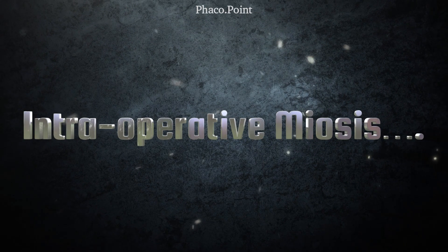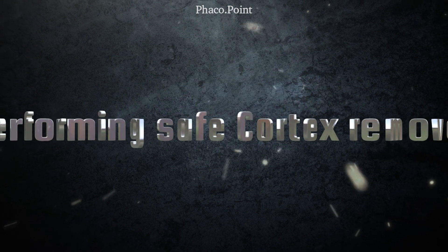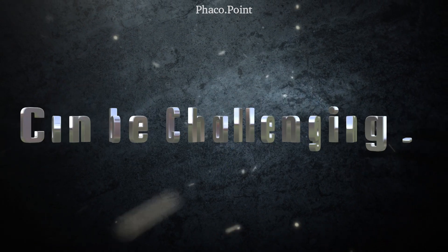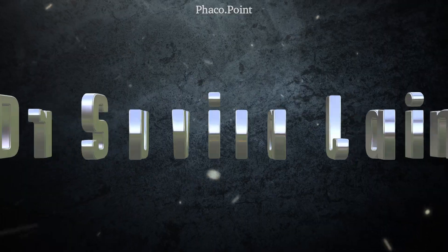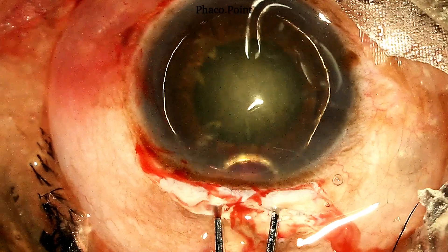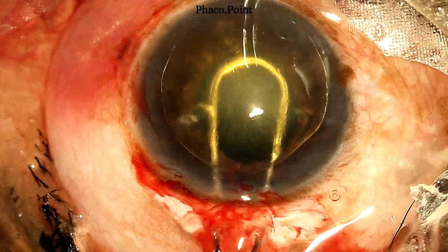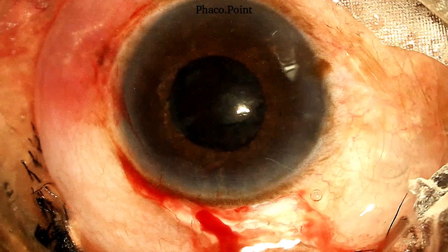When faced with an intraoperative miosis while performing SICS, the removal of the cortex can pose a significant amount of challenges. Let's see how it was managed in this particular case. This patient was undergoing a manual SICS for an early nuclear sclerosis. Upon the removal of the nucleus, you can see that the pupil size has come down.